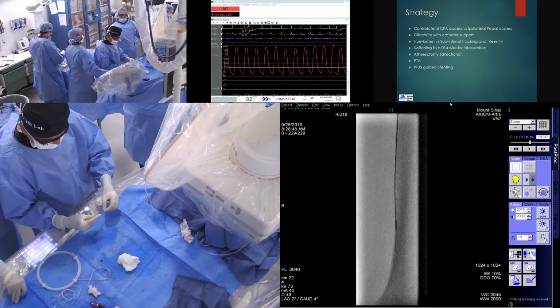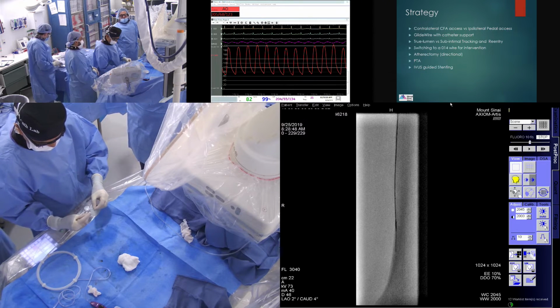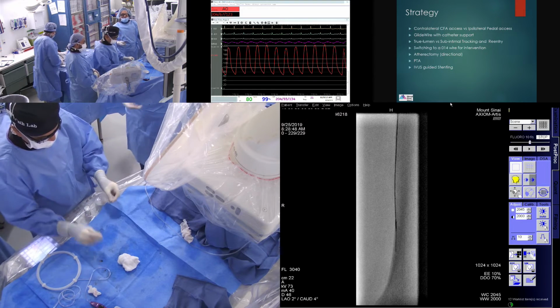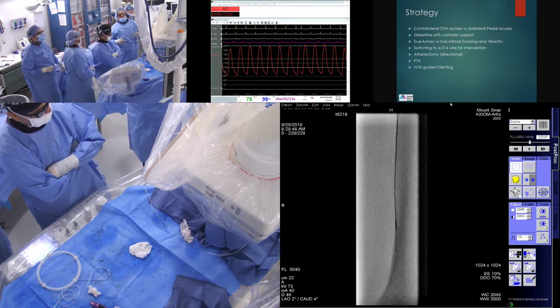Well, I can knock off the genicular collateral and not succeed in my intervention. Well, that's going to make them worse. Number two, I can embolize something, shut down my distal vasculature. That's going to make them worse. Three, I can dissect the vessel shut distally. That's going to make them worse. And four, I can angioplasty the crap out of the entire foot.